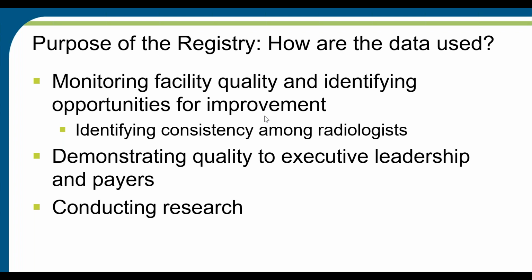How does new technology impact what we're doing? Do we get our money's worth out of the new technology? And where can we do better as a whole? So that's really the purpose of the registry for the National Mammography Database, and I think also of a lot of the registries for the ACR in general. Next slide, please.